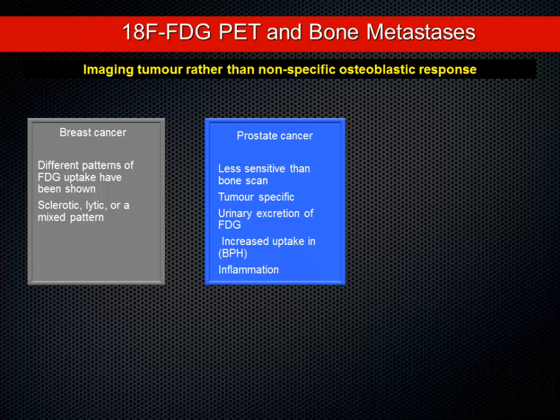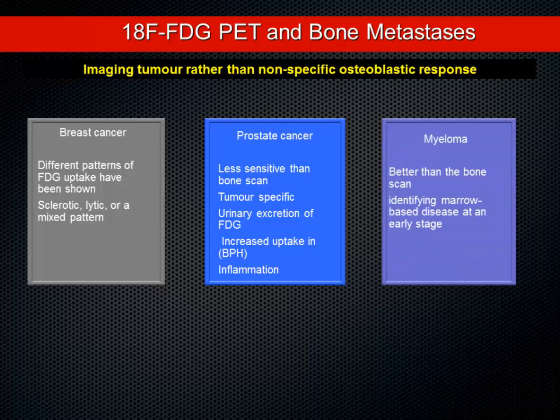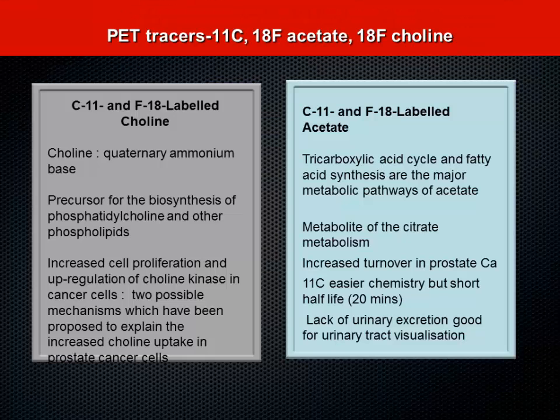And of course, there are other physiological challenges like urinary excretion of FDG, increased uptake in benign prostate pathologies, and also inflammation can show FDG uptake. So still, we need more evidence to say FDG is useful in this scenario. Myeloma, they say FDG is definitely better than bone scan because you identify early bone marrow disease.